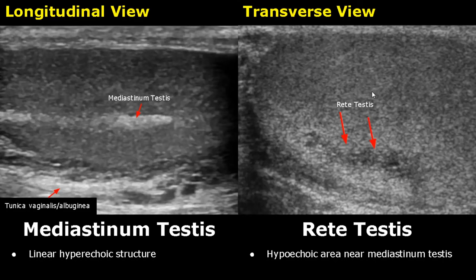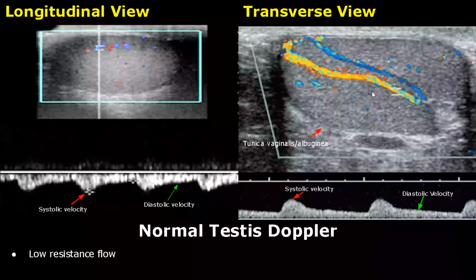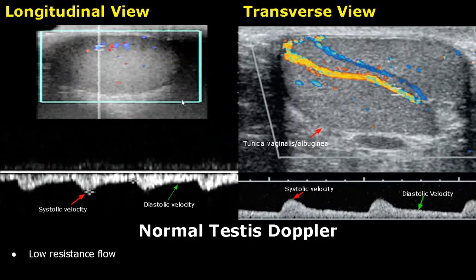The spectral Doppler waveforms of the testes have a lower resistance flow. This is the systolic velocity and here is the diastolic velocity. It has a large quantity of forward diastolic flow.